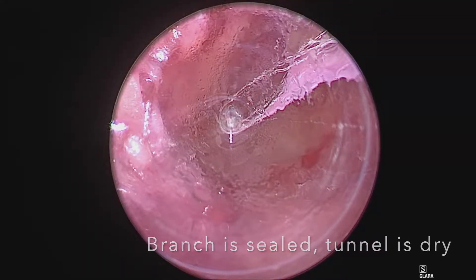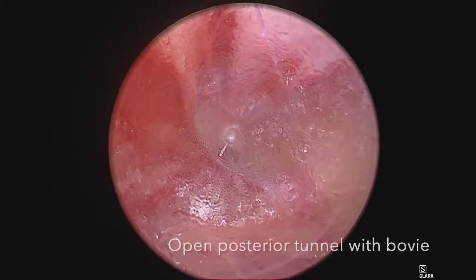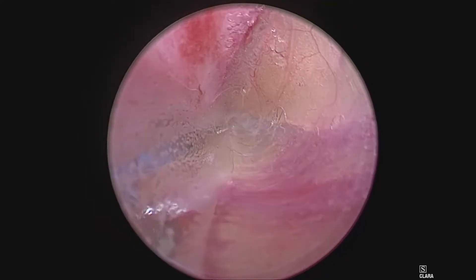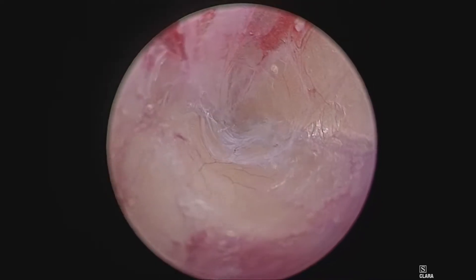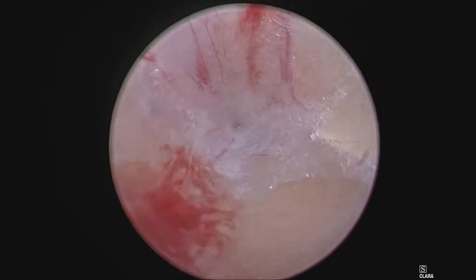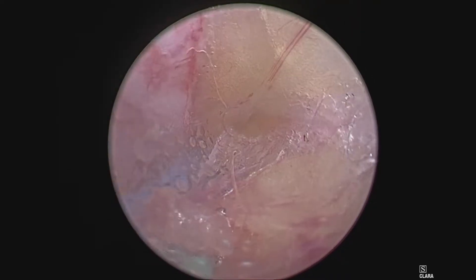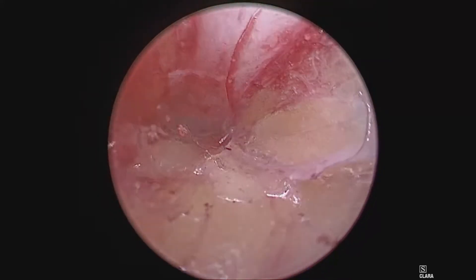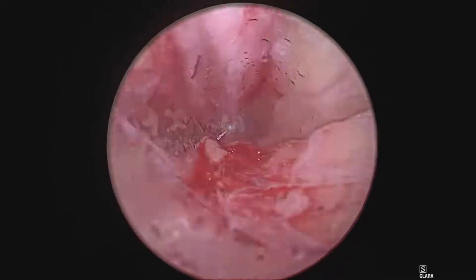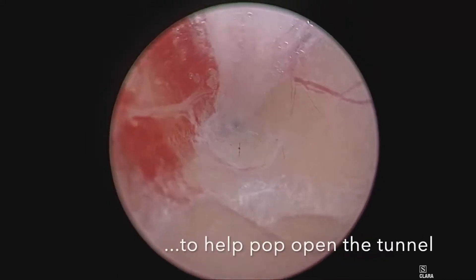Continue your posterior dissection at 6 o'clock. If you feel resistance, retreat. Spin the scope to 9 o'clock or 3 o'clock and use your blades to open up the tunnel, reduce resistance, and reduce the chance of creating any bleeding. Continue to dissect only at 6 o'clock unless you identify a branch. Here I feel a little resistance, so I'm going to open the tunnel up with the blades. Any bleeding that I see, I immediately cauterize and continue my dissection at 6 o'clock.